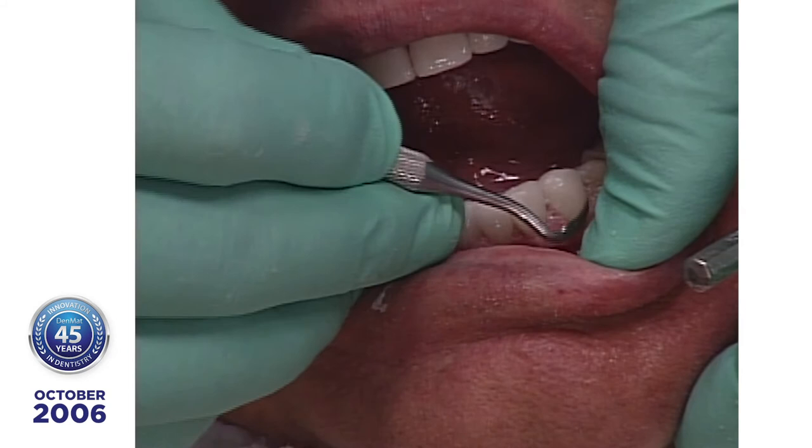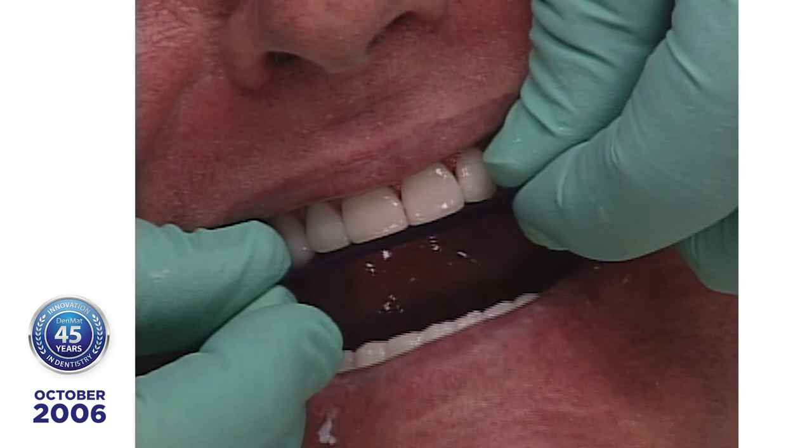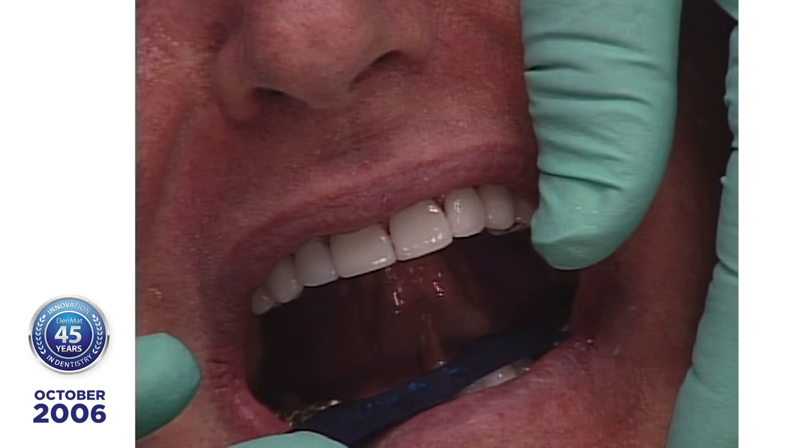No, I'm just scaling with my Shure 349. All these instruments are in the finishing kit. Okay, open. Close. Gently grind your teeth around. Now, this is critical in here that you get the occlusion right, because if you don't get the occlusion right, you got big problems. Open.